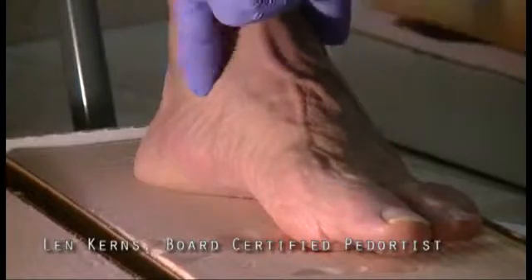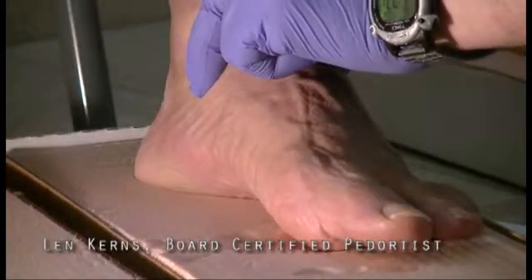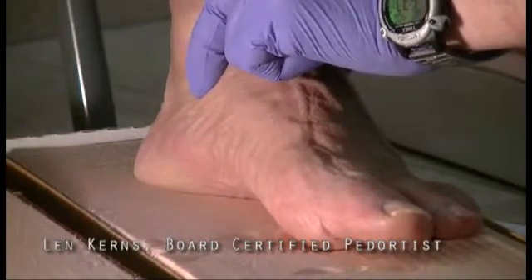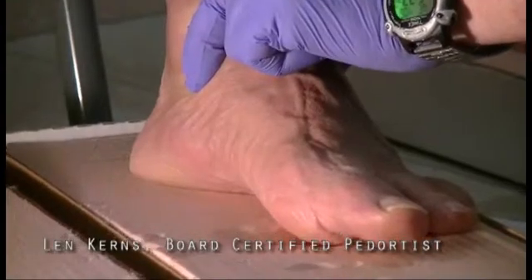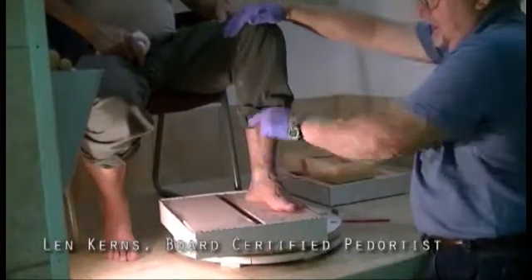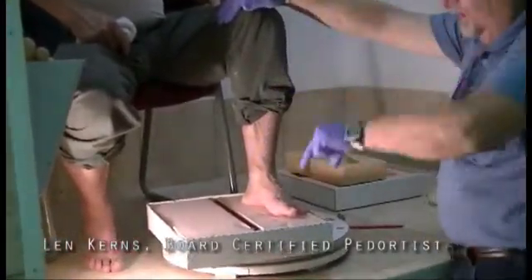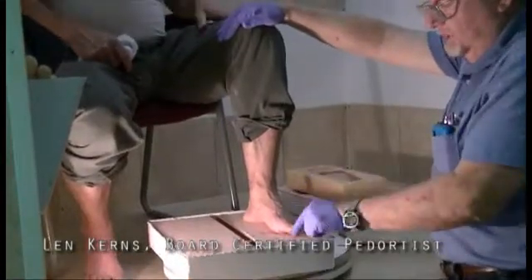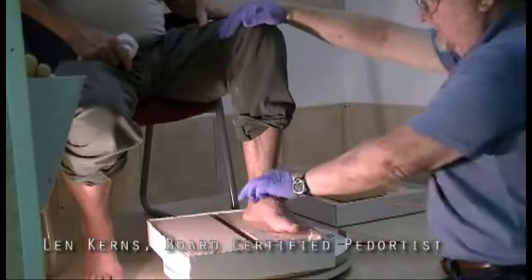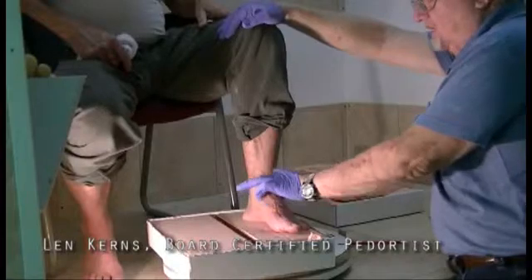So at this point, and this is very important, I'm keeping my 2 fingers on the navicular talus joint. I'm going to place my hand on the knee, and I'm only going to push 25 to 30% on the knee. Remember, you will be up on your knees, so you'll have more pressure. You're going to press 70% on the instep. Also, these 2 fingers are going to steer that heel from going to the left in the foam or to the right, and also help to push the arch down.